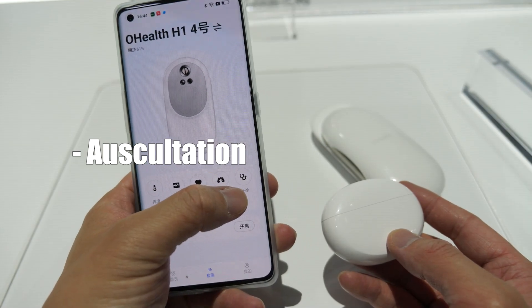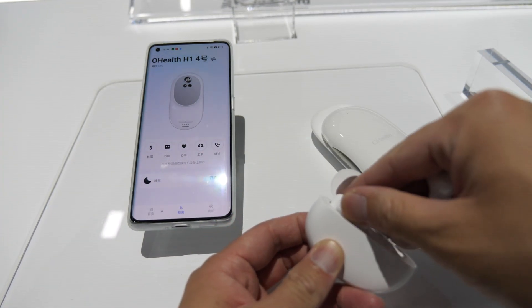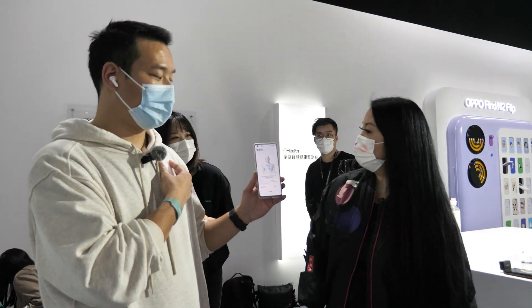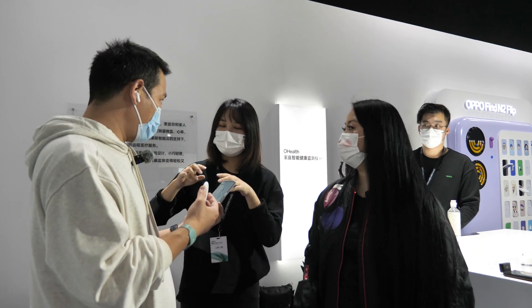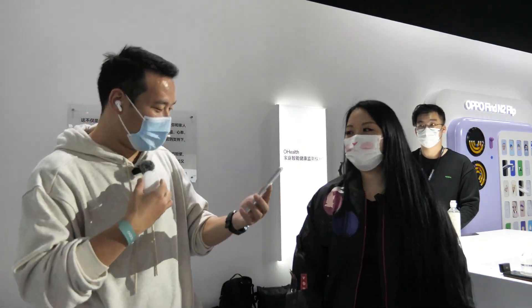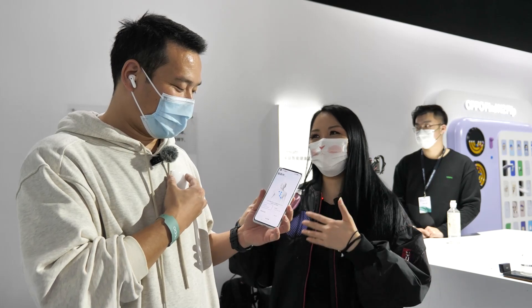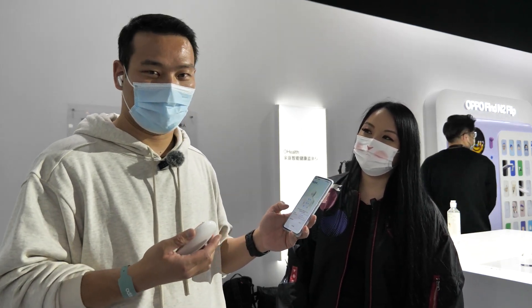The sixth item is auscultation. In order to use this feature, you have to connect your earphone first. You have to use this in a really quiet environment. You have to put it inside, touching your skin. So Sammy, do it yourself — you can do this at home, and this is for the back. After that, they will generate a report.